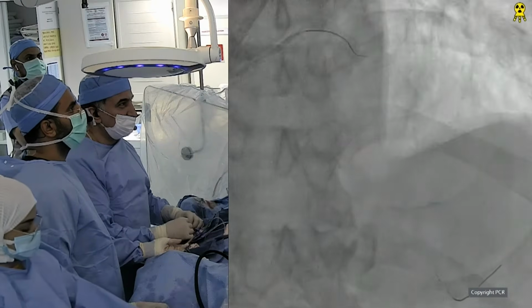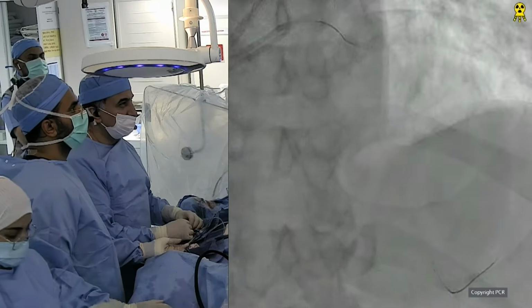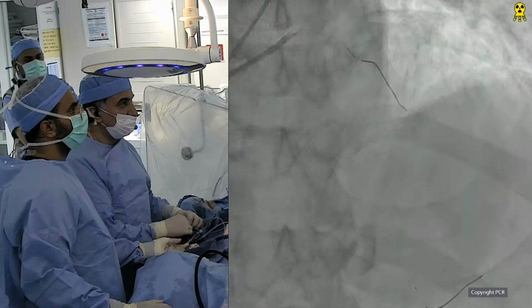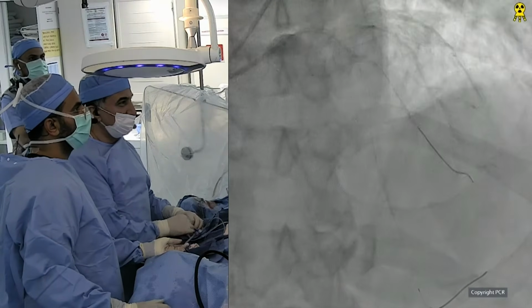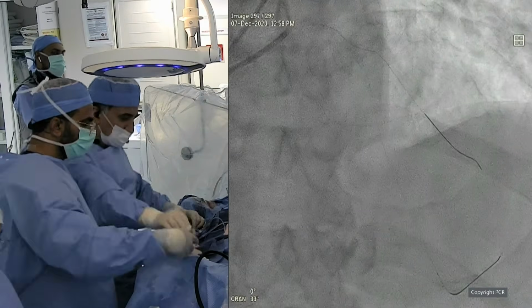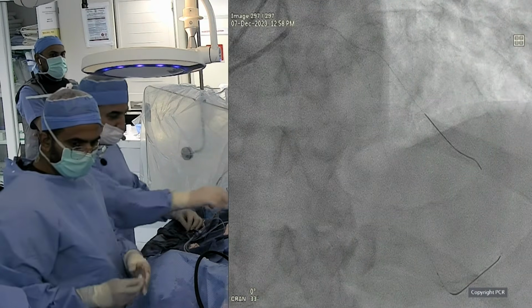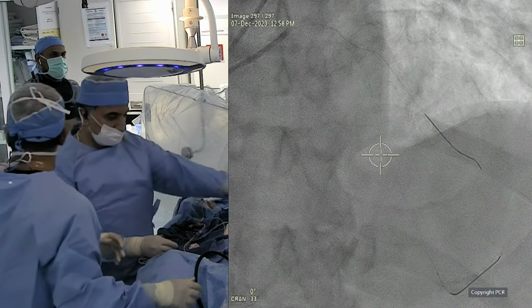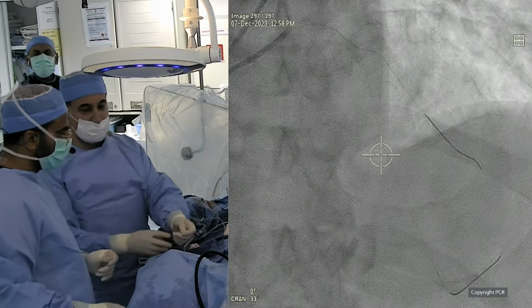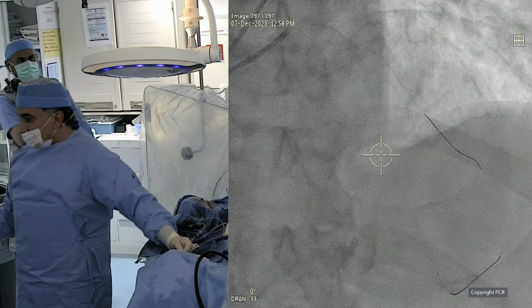Goran, while Hussein is working there and going with the calcium that Joel, you alluded to as well, which is heavily calcified ostial and the massive big diagonal as well. Do any of the panelists or anybody would do imaging at this moment, because do you want to modify the plaque before you do a two-stent strategy? Dilate with a small balloon, so that they don't fail to expand and then you regret.